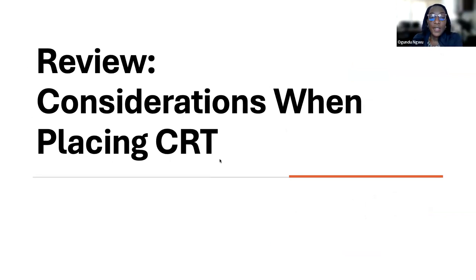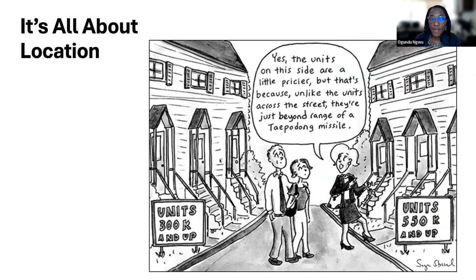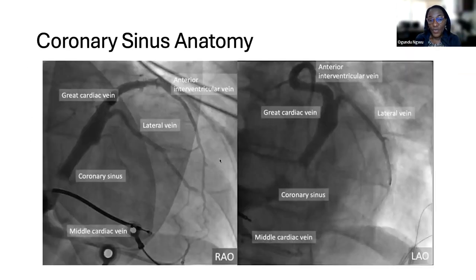So we're going to consider considerations for when placing a CRT device. We're going to run through this very briefly. And it's really all about the location of the LV lead. And it is true that sometimes you may have limitations based on the cardiac anatomy, but I think understanding essentially where you want to place this lead is critically important.